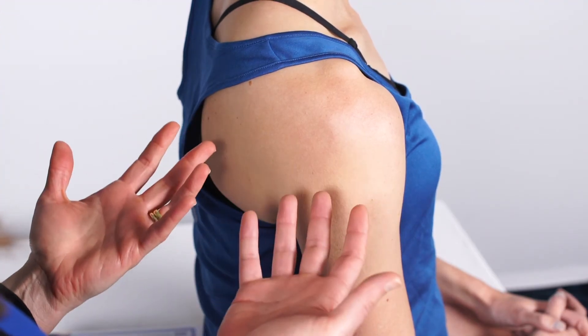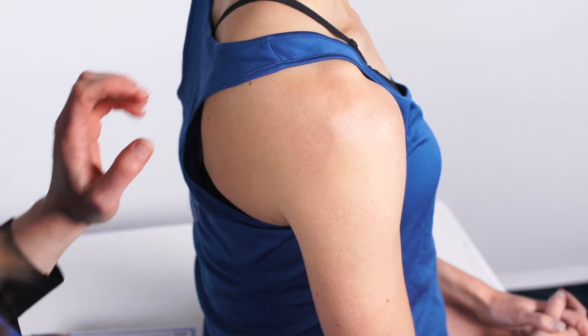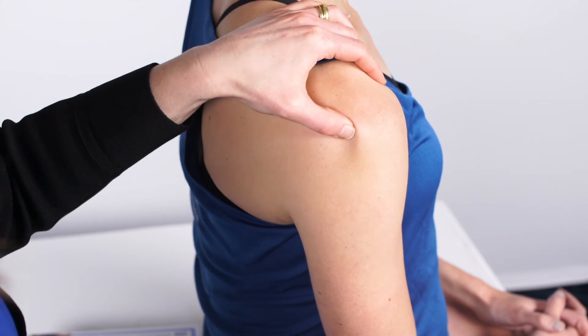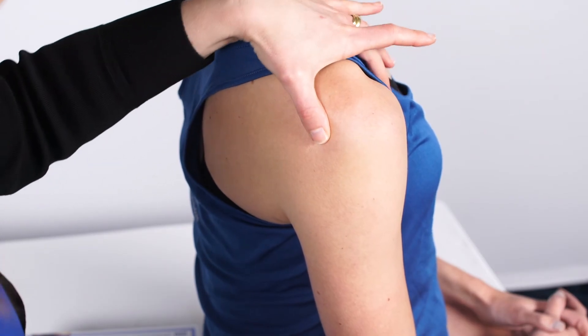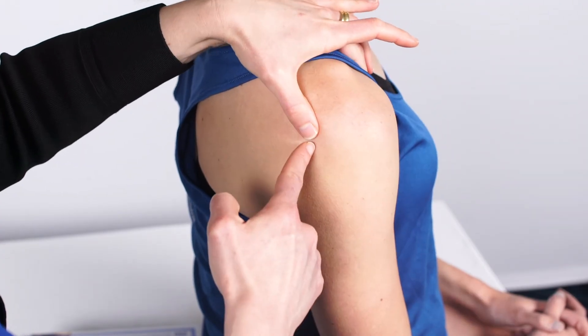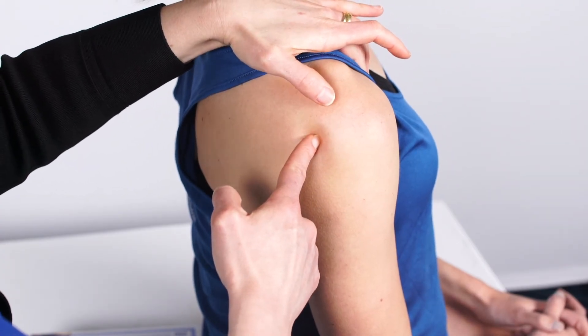The posterior approach is also really comfortable for the patient — they don't have to see the needle. For the posterior approach, the landmarks are the posterior lateral border of the acromion and then the coracoid anteriorly. By feeling the coracoid anteriorly, that's the direction you're going to angle your needle.